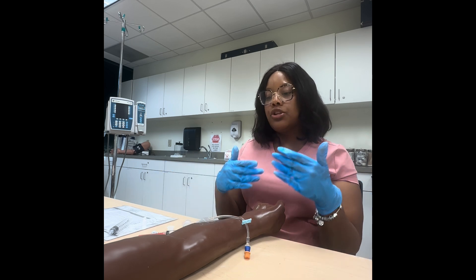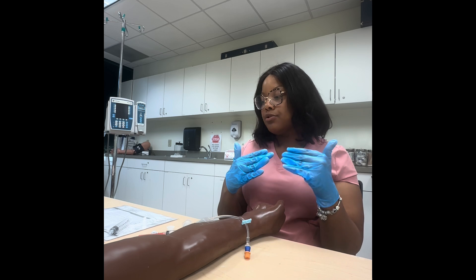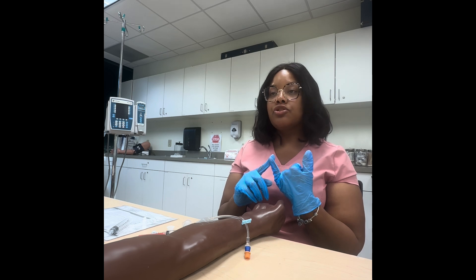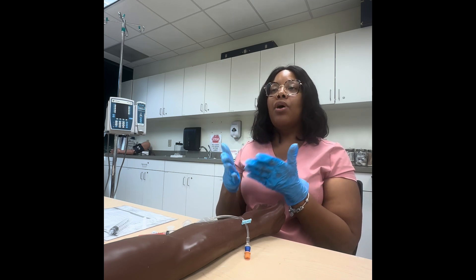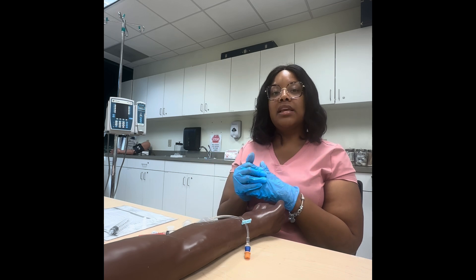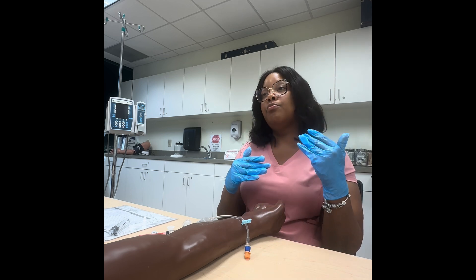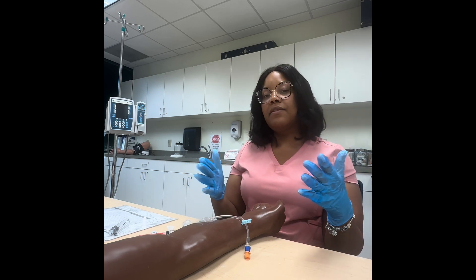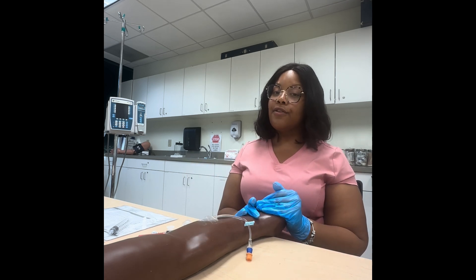Clamp it and tell your patient: 'Your medication should be kicking in shortly — let me know if you need anything.' That covers administering medication via IV push and how to flush an IV. You flush before medication administration, after medication administration, and between medications. If giving multiple IV medications, flush with 10 ccs of saline between each. Also flush before and after blood draws on a central line. Always be flushing your IV accesses.